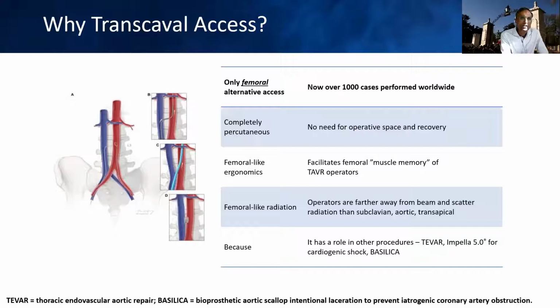The majority of it comes down to case planning in deriving these ideal angles and location of the inferior vena cava in proximity to the abdominal aorta. We identify these positions both in relation to the lumbar spine behind it, and then derive the appropriate gantry angles so that we can identify the location for ideal electrosurgical puncture from the inferior vena cava to the abdominal aorta, both in an anteroposterior position and a lateral camera view, although we can do a lot of this now in the AP view by itself.